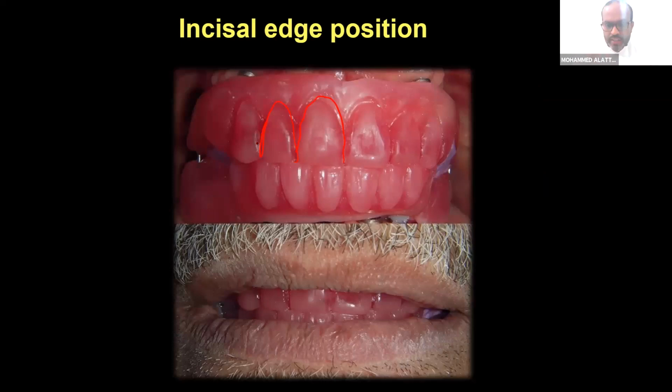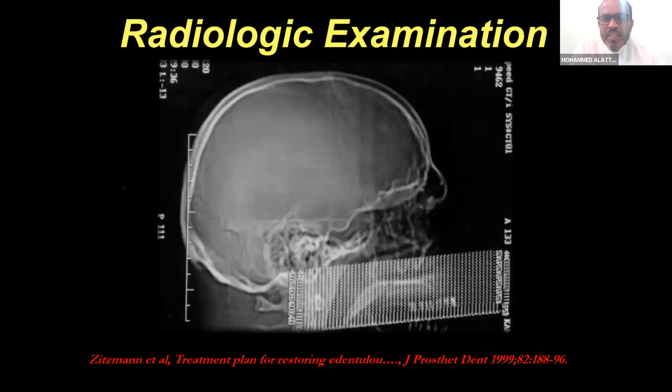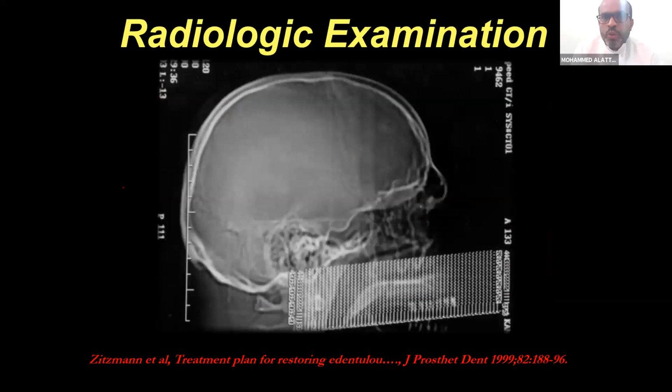And also we can examine the patient's removable prosthesis with the flange and without the flange to see how the patient looks when he smiles, because when some patients smile and have these flanges, it will make a difference when they smile and also when they pronounce some sounds.